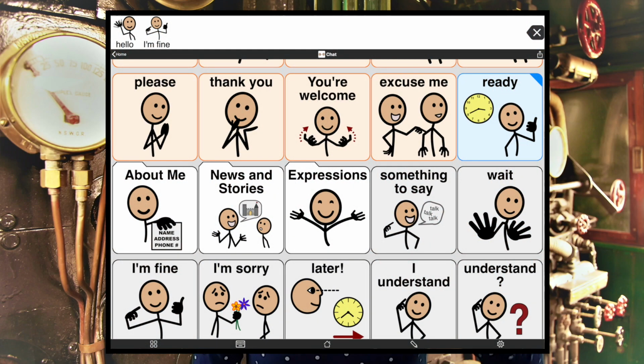Maybe you want to say, Hello, I'm fine. All in one message. Tap Hello. Then scroll down until you see the I'm fine button and tap that. To deliver the whole message, tap the white message bar. You should hear, Hello, I'm fine. How are you today?